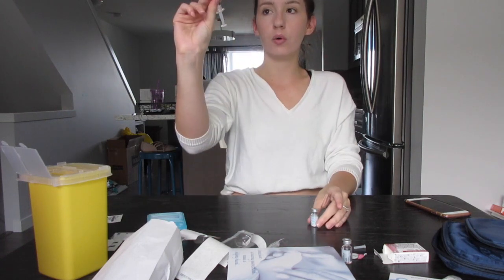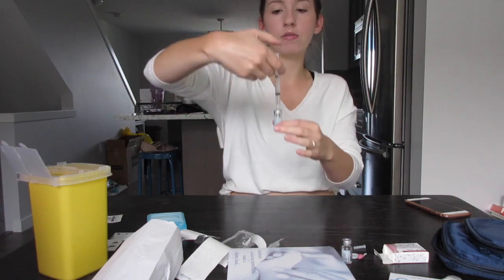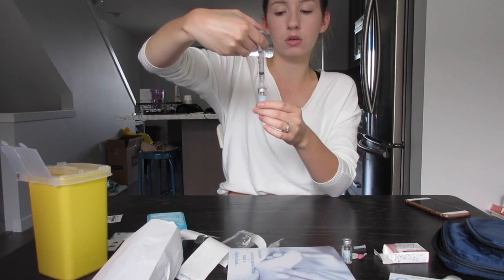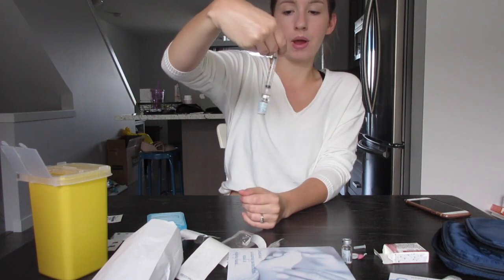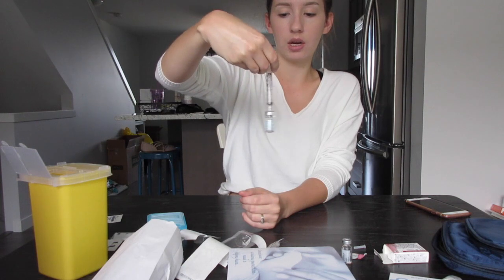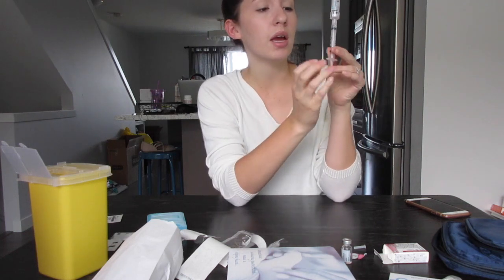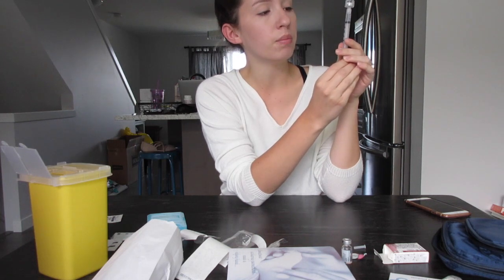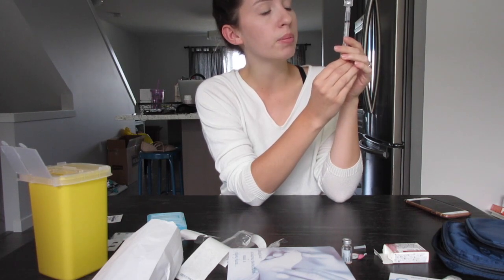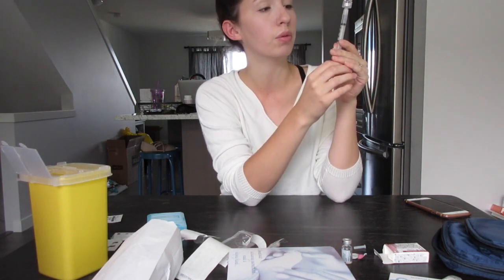So next we are going to place our Q-cap and our syringe onto the powder vial. So we are going to push down and then we are going to take our fingers and push the solution into the powder. Now you just want to mix it a little bit. It dissolves right away, but you just swirl it a little to make sure that it is fully mixed. And then we flip it upside down and we let go. So now we're taking that liquid back in. So it will be back to one milliliter, but it will basically empty the entire vial because that's the amount of liquid that you had put in from before.